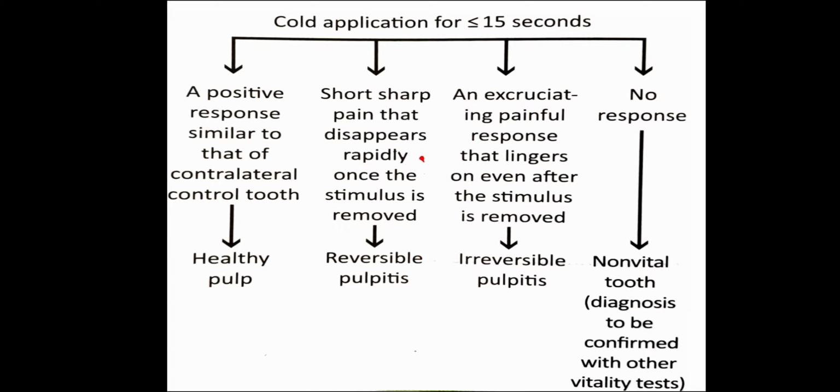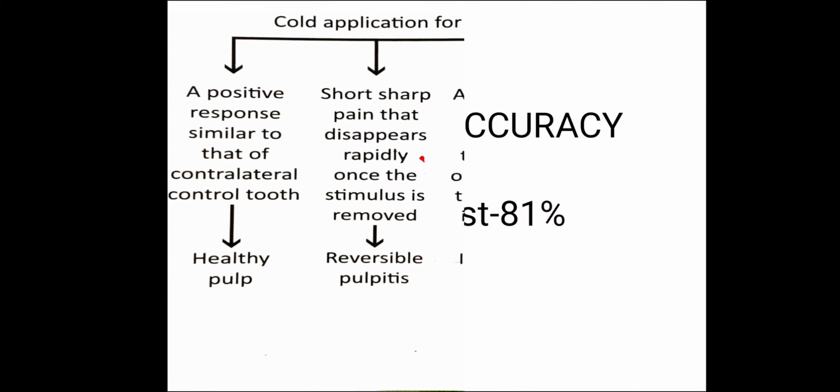If the pain persists even after the removal of the stimulus, then it is a case of irreversible pulpitis. And if no response is seen, then the tooth is non-vital. However, the diagnosis is definitely confirmed with other vitality tests.